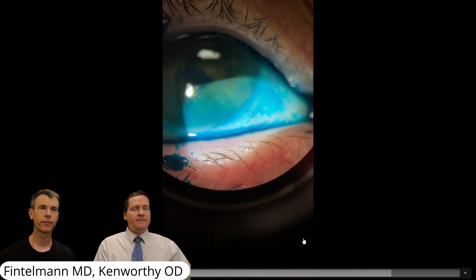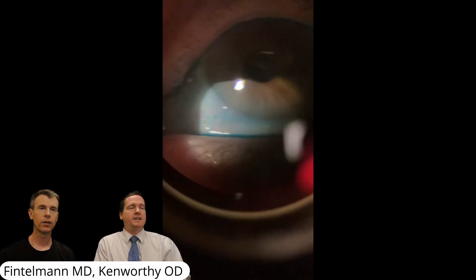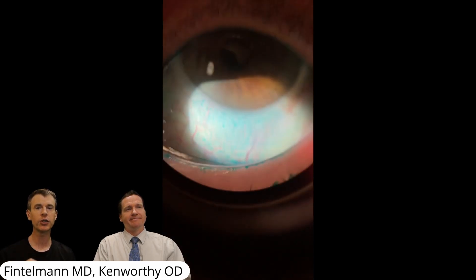And this is the staining of the conjunctiva, a very good area that you can stain with. We can also use fluorescein in some cases, but Lissamine green is what we used here. And the other important thing to tell the patient is their vision will turn green momentarily.